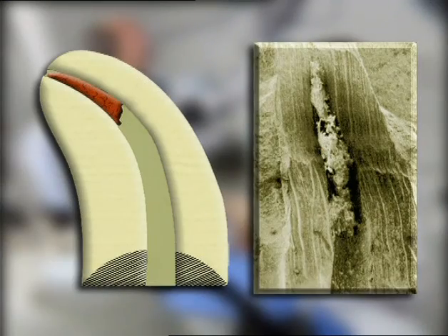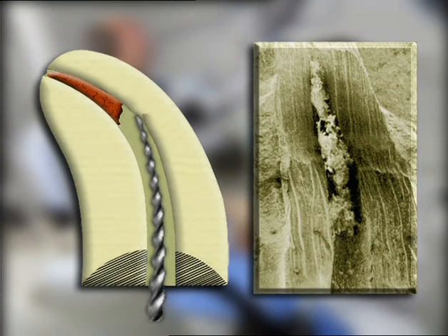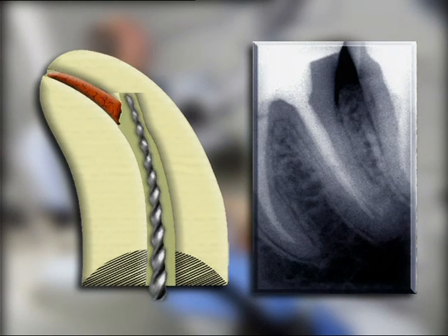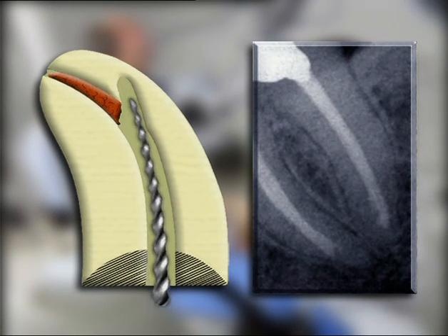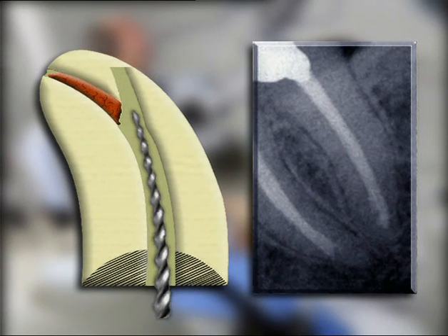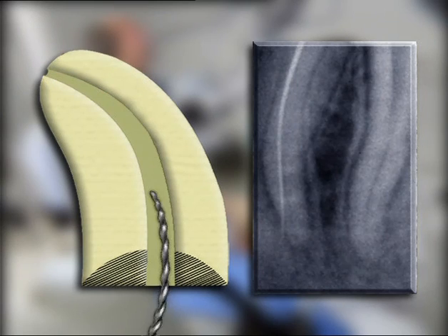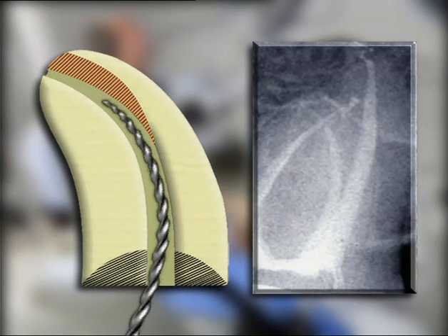The apical foramen should remain in its original spatial relationship, both to the bone and to the root surface, without any type of transportation. An internal transportation occurs when the foramen becomes clogged with dentin mud or denticles. Clinically, it is characterized by the loss of working length or leads to a new false path. External transportation means the tearing of the apical foramen or a direct perforation. The foramen should be kept as small as practical.